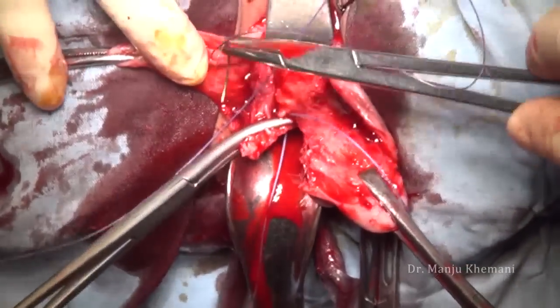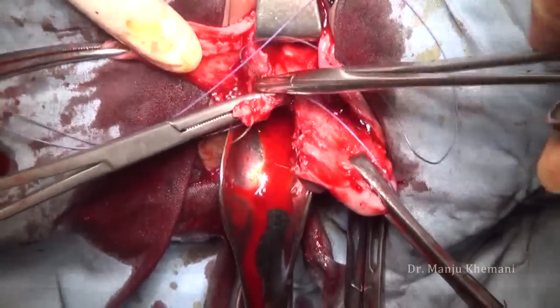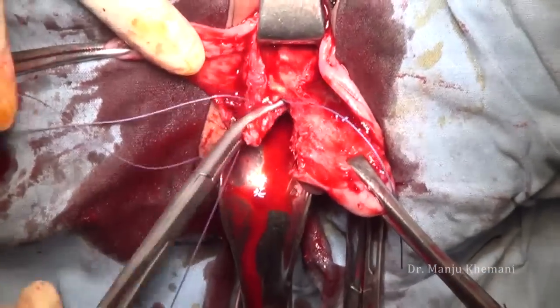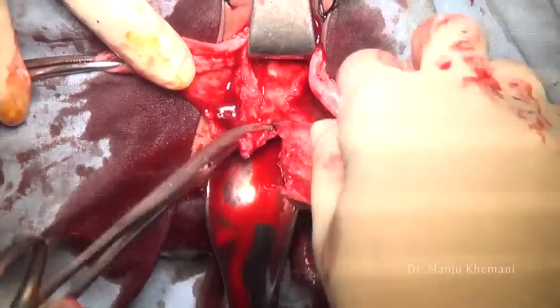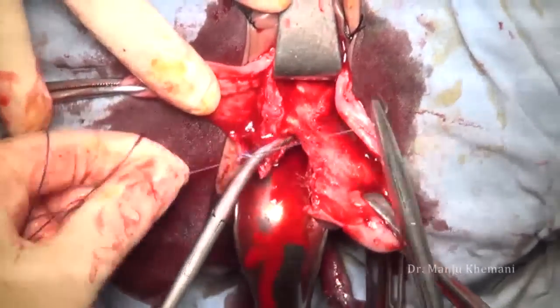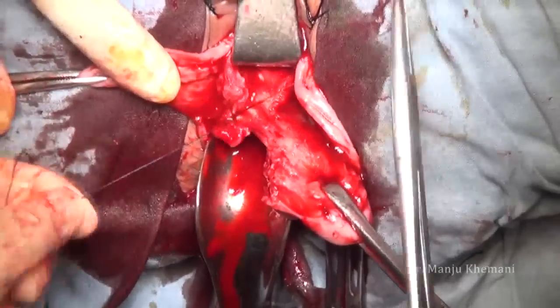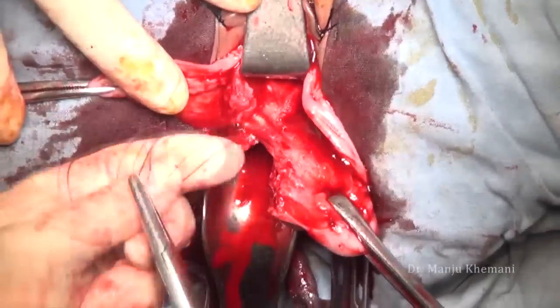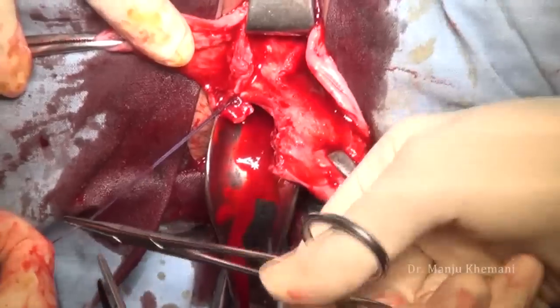The first knot is always a double knot so that your stump is very tightly closed. Do not use all granny knots — you have to use one reverse knot so that your pedicle is secured. This is the granny knot. Catch hold of it to identify the uterosacral; I catch hold of these ligaments with a straight clamp.